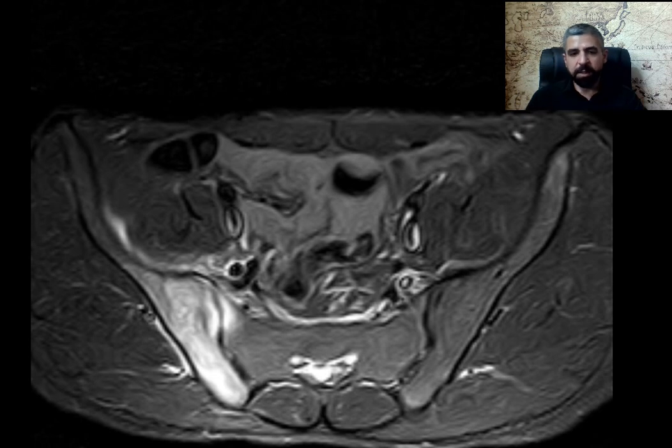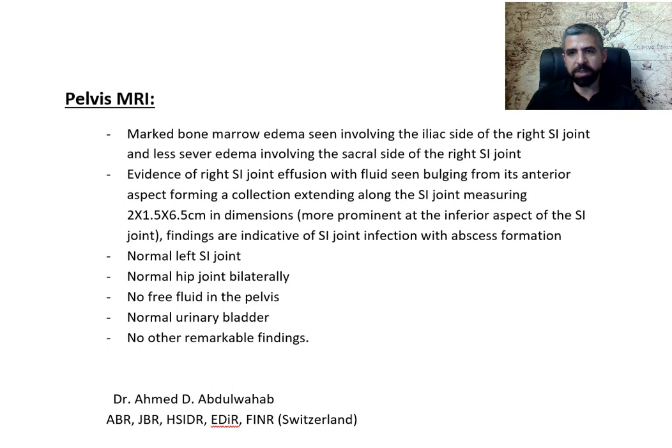One of you guys suggested that I show you the report, or how this case was reported, so that you get more oriented. Some of you who need help will be more oriented on how to write the radiology report. Personally, I'm in favor of writing a short, concentrated report. I don't like the long reports that have a lot of normals and a lot of no significant or no clinically significant words or sentences.